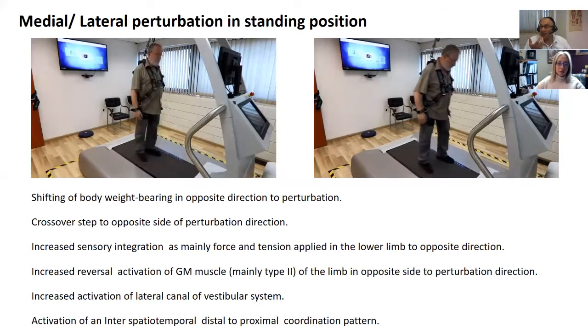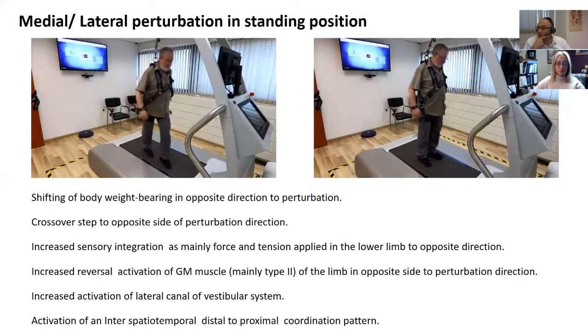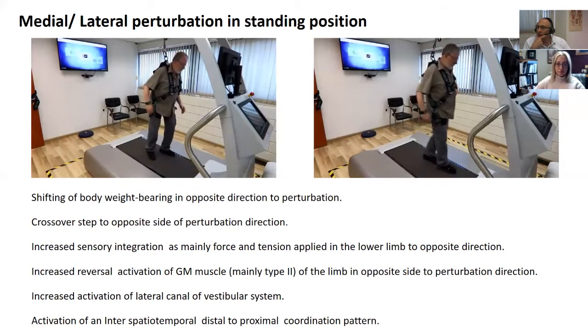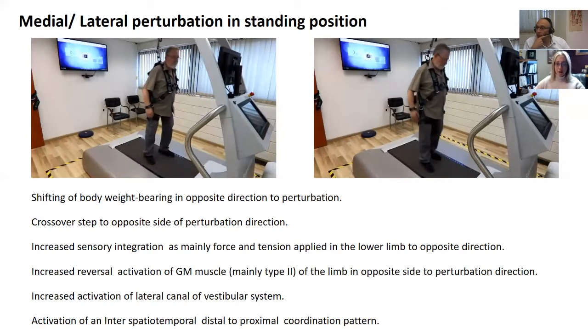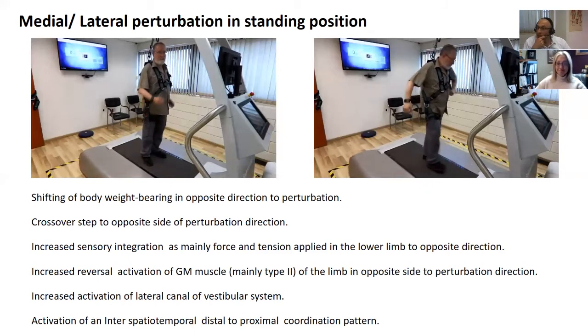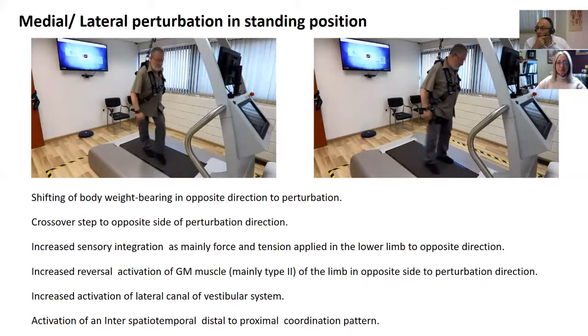So he's activating, if you like, more of a forward flexion of the hip, correct? Do we see any knee activation at all when he does that? A little bit, yeah. Absolutely. Mm-hmm. Yeah, I do see it. Great. Do we see any dorsiflexion? We see some of that as well, correct?